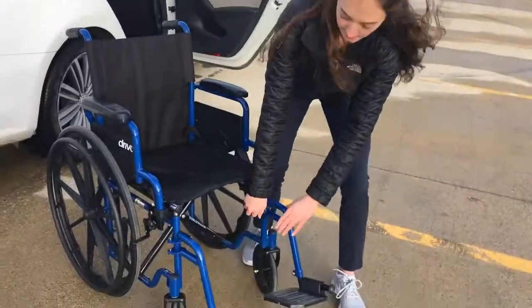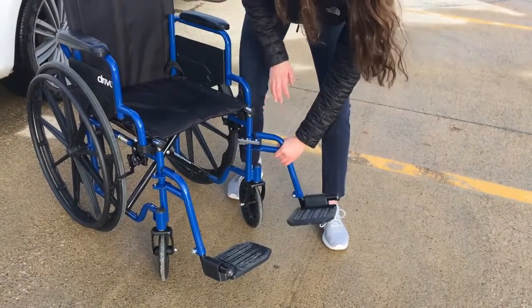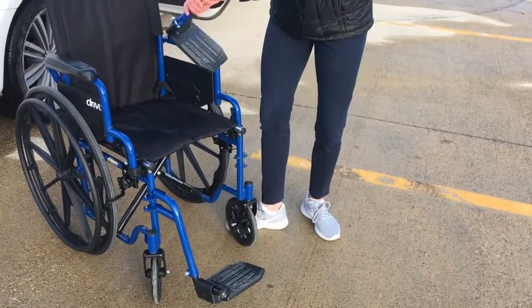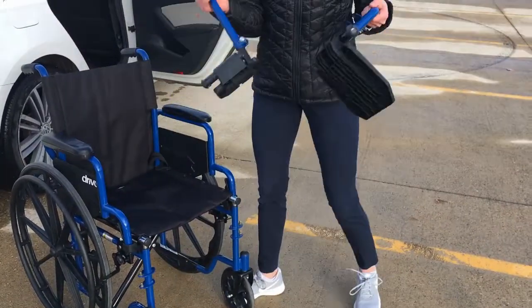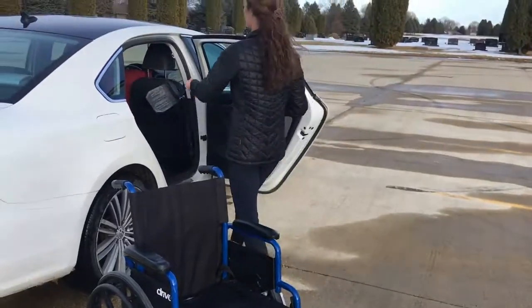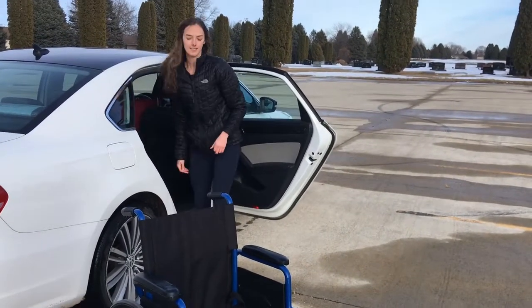Step one is to take off the wheelchair footrests. Usually this is just by pulling a lever underneath the wheelchair and twisting it off. You can just put these on the back seat of your car.